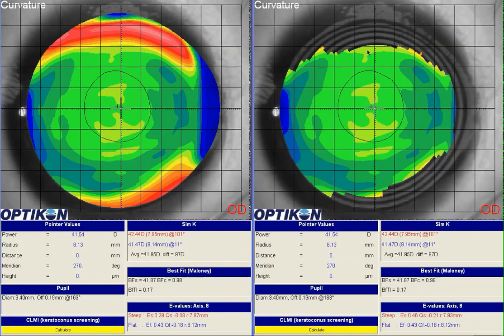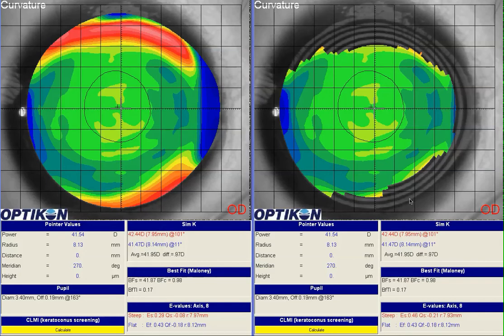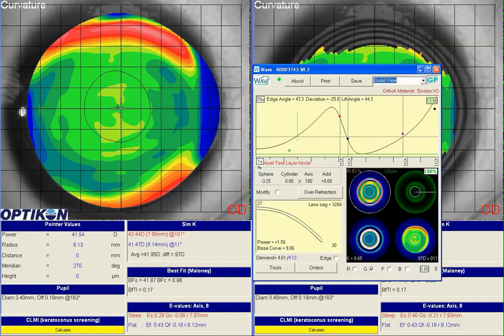Here now we have the baseline topography with those areas deleted. It is deleting a lot of data from the map, so I would feel safer for my own patient by retaining the original map. Through a series of exports and edits, you can have the original maps and then also a second set of edited maps to build a new lens off of. If you have questions about those specifics, feel free to let me know by email. Once you delete those rings, that data is lost. So going off of this new map, I designed a lens with very similar parameters.